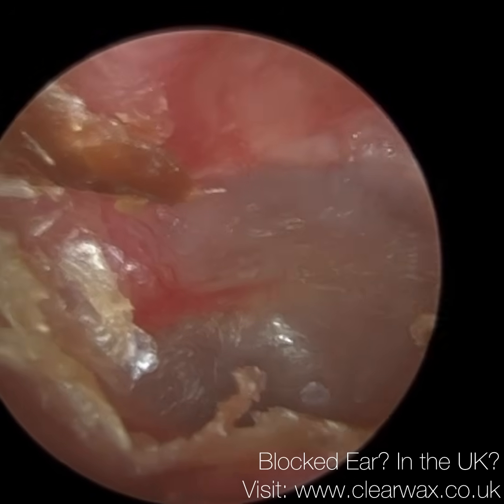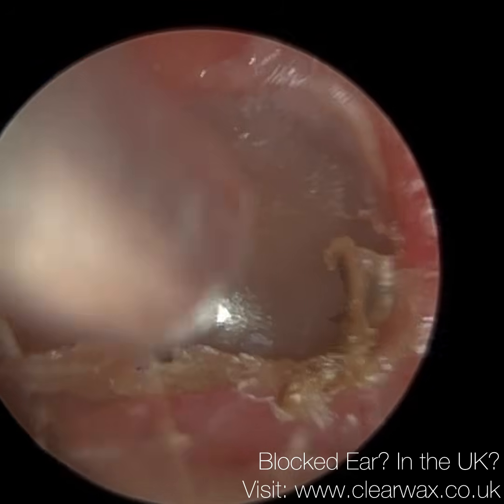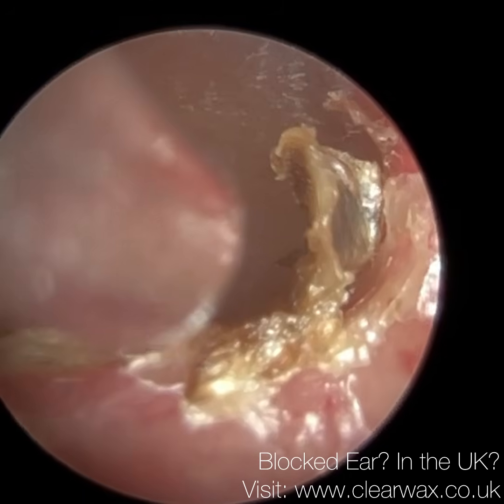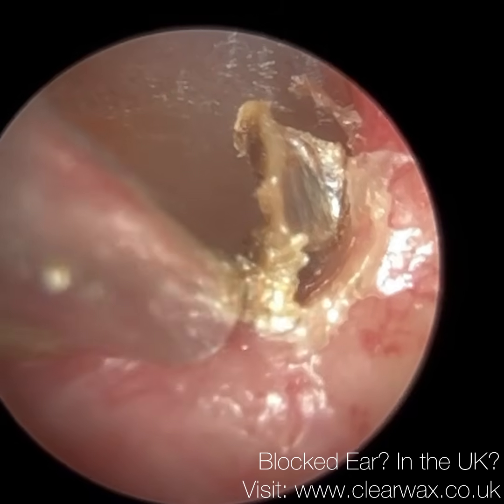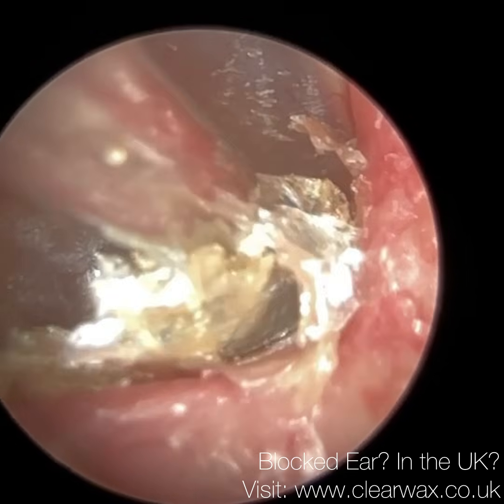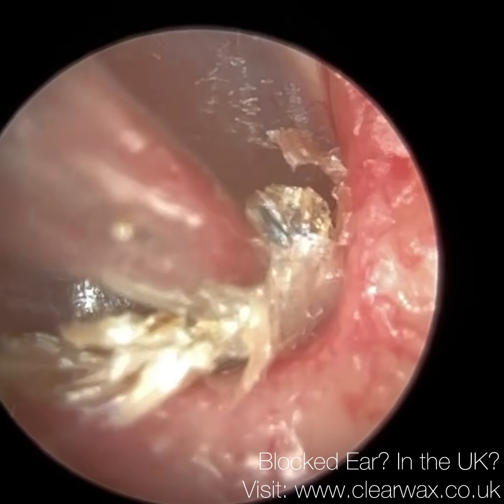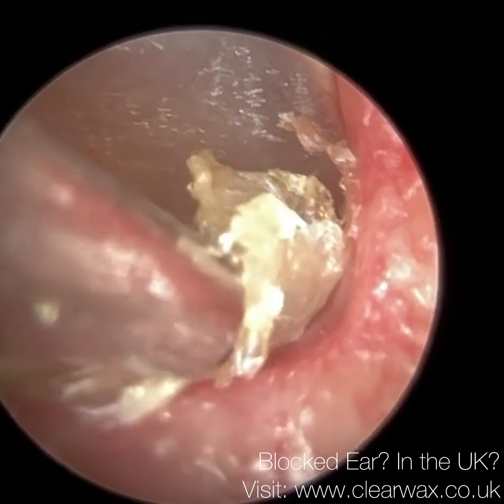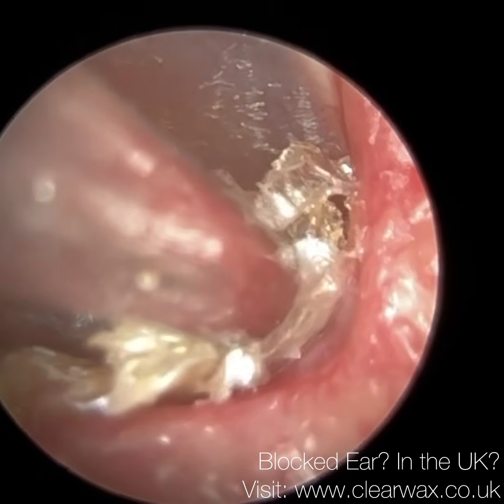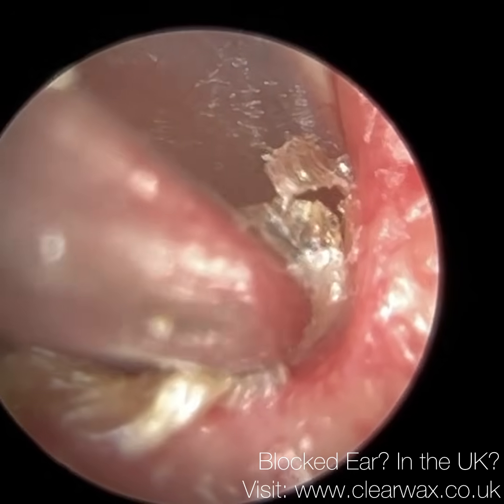Now what I want to do now is just peel away as much skin as possible. And there was a layer of skin on the eardrum, I think, which also came away when I removed this plug. So just where I am now, that's the border, the perimeter of the original ear canal, and it's almost like a cliff edge. I don't know if you can see that. Just where I am now, just before the ear canal kind of comes down, and that's the widening. Again, this skin is extremely thick.